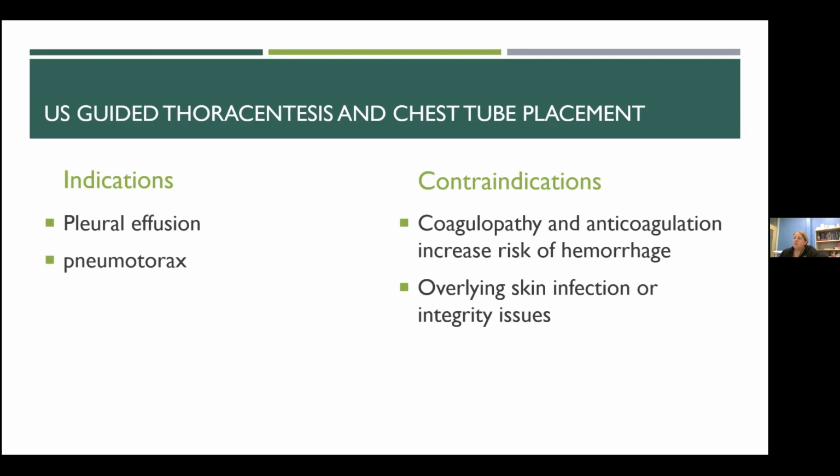Indications for either of these procedures is effusion. So whether that's empyema, simple fluid, or reactive fluid to an infection, and also pneumothorax, pardon the typo there. So either air or liquid, something needs to get out of the cavity. Again, when you're thinking about contraindications, these are all relative. Sometimes your patient needs the procedure no matter what the risks are. You just have to weigh those really carefully.